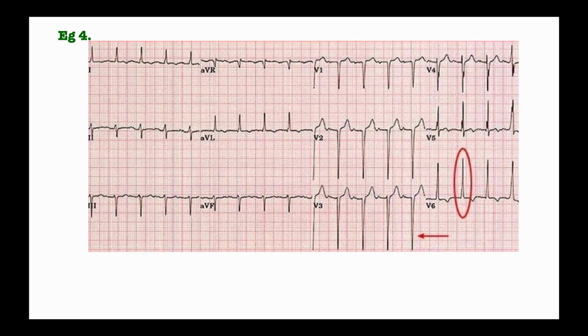Oh, I think I have one more. Okay, so we are going to use aVL plus V3. Let's count. We have 5, 10. Then let's count V3. We have 5, 10, 15, 20, 25. So 25 plus 10, we are getting 35.